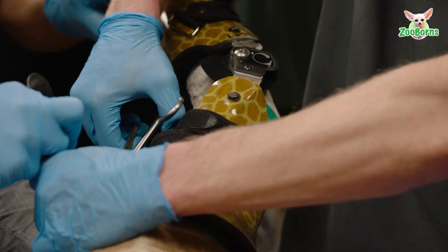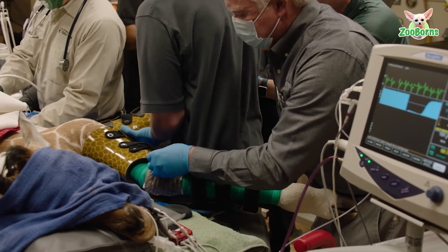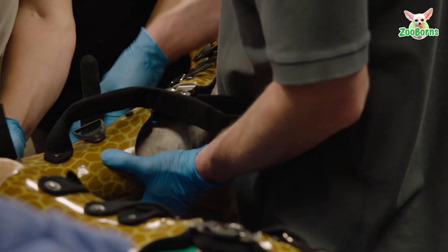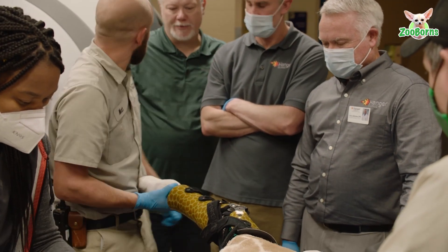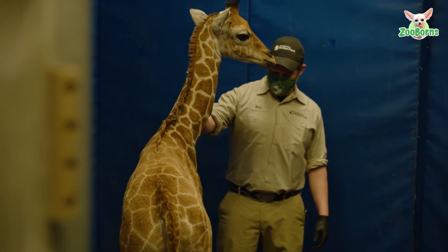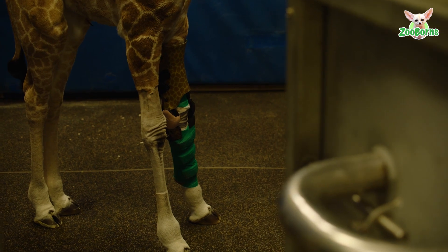This giraffe came in right at the time of birth — the day she was born she was presented to the hospital. The biggest concern was that the forelimbs were hyperextended at one of the joints. Over the course of 24 hours, the second forelimb started to hyperextend as well. It looks like their knee but it's actually the carpus. The hyperextension — the joint going the wrong way — was the big concern. So initially we stabilized that joint with a cast while we had time to purchase off-the-shelf braces and applied those the next day.